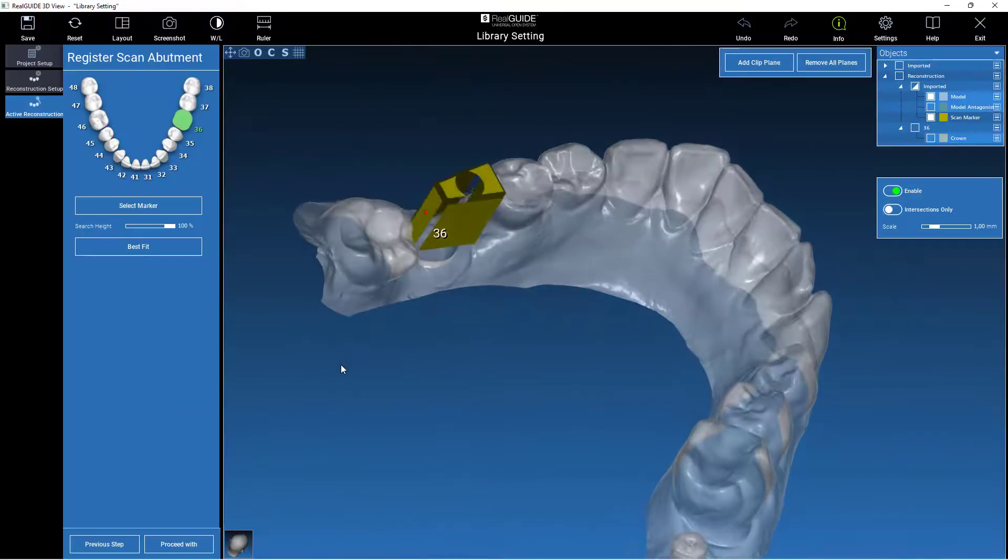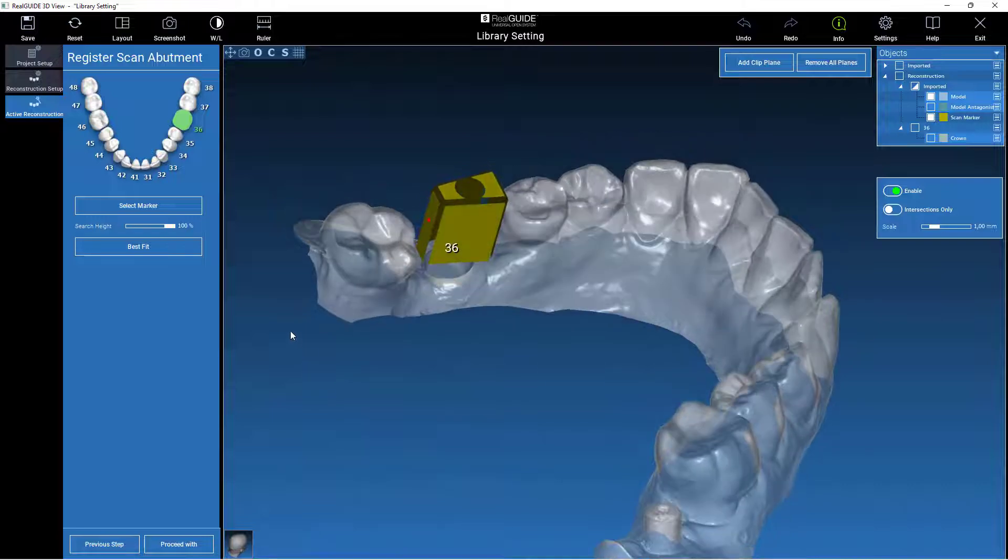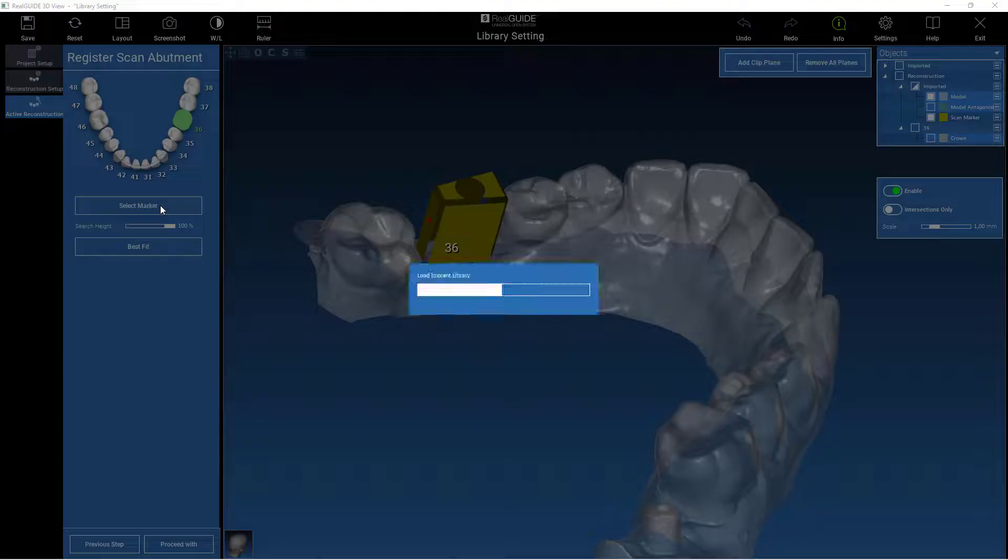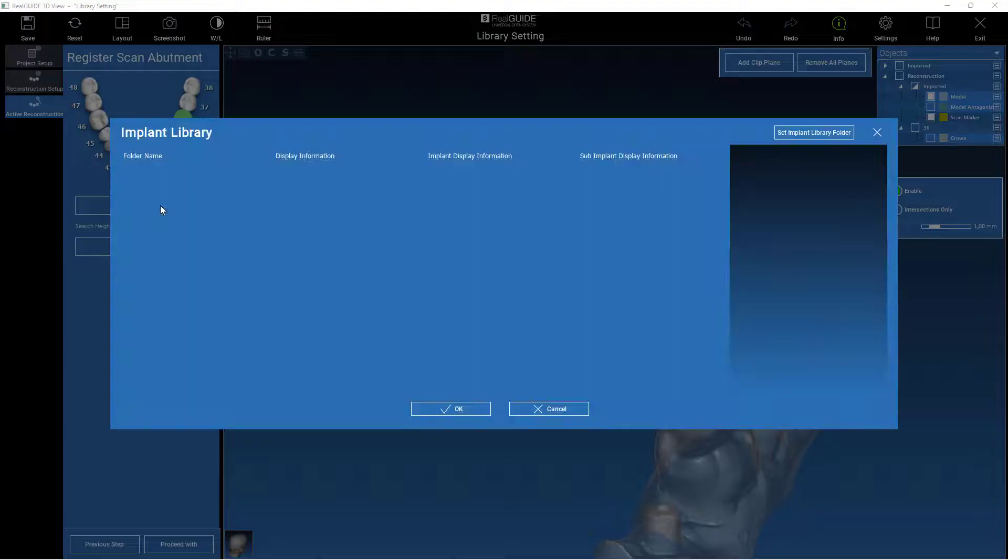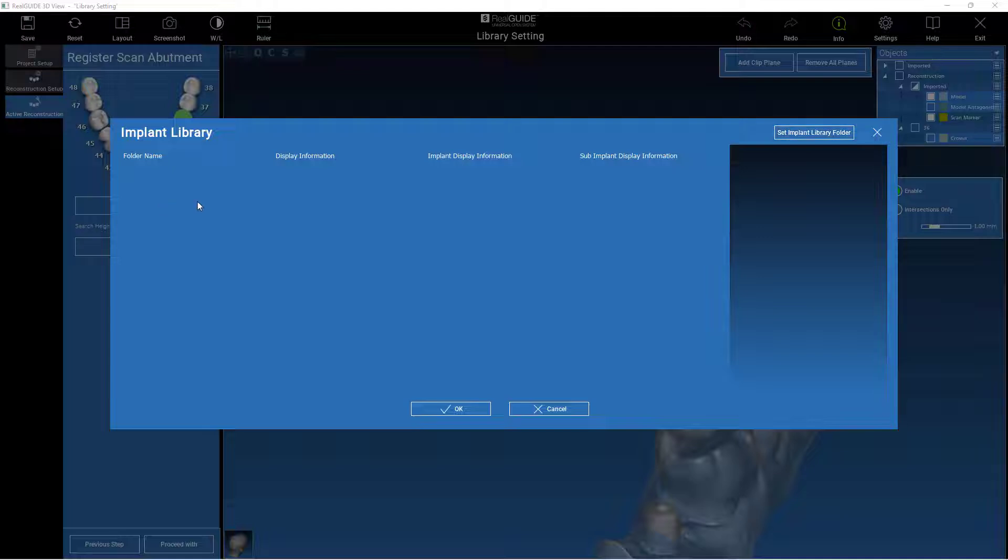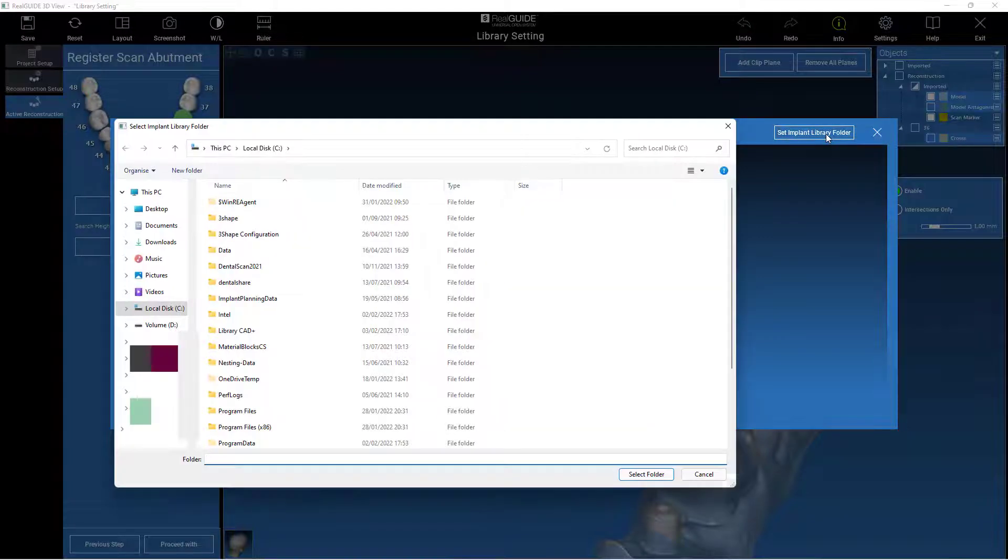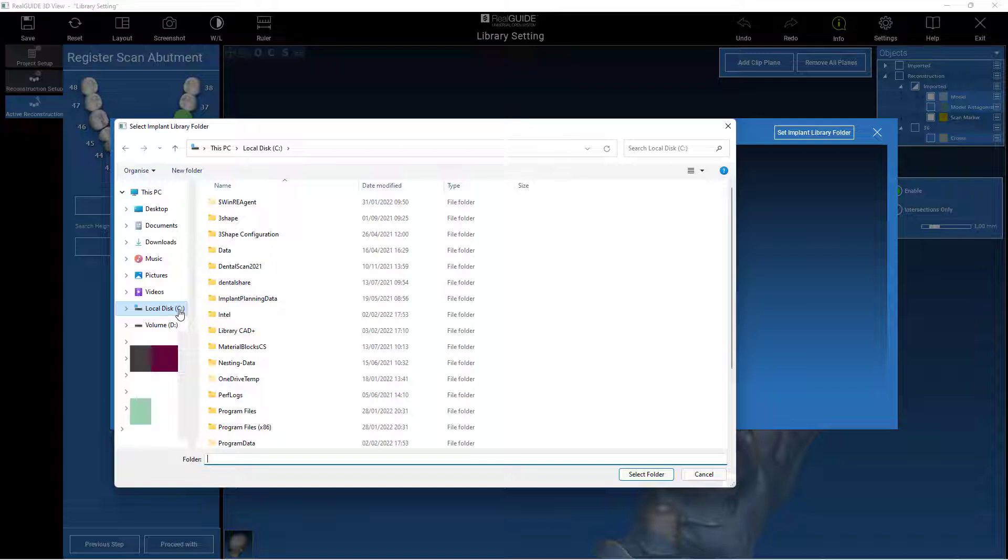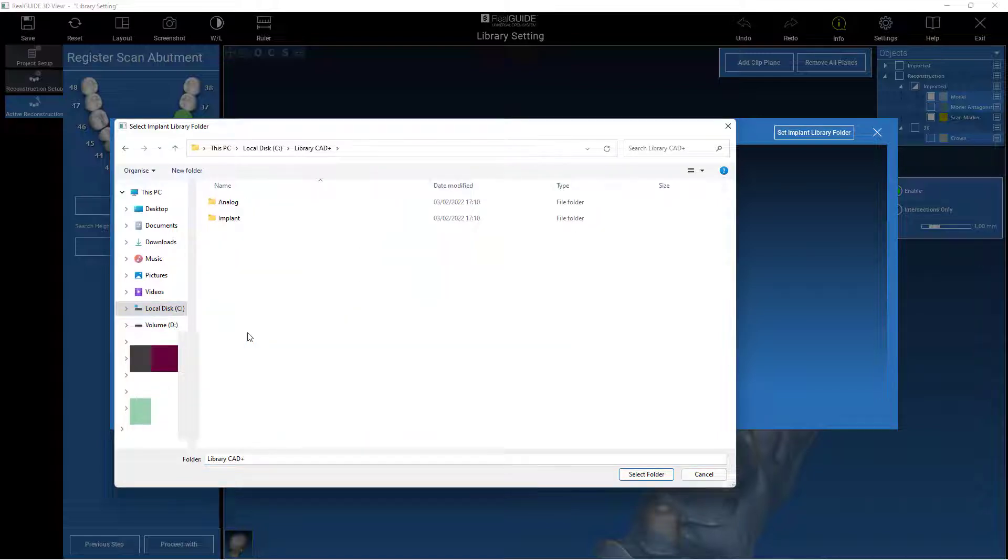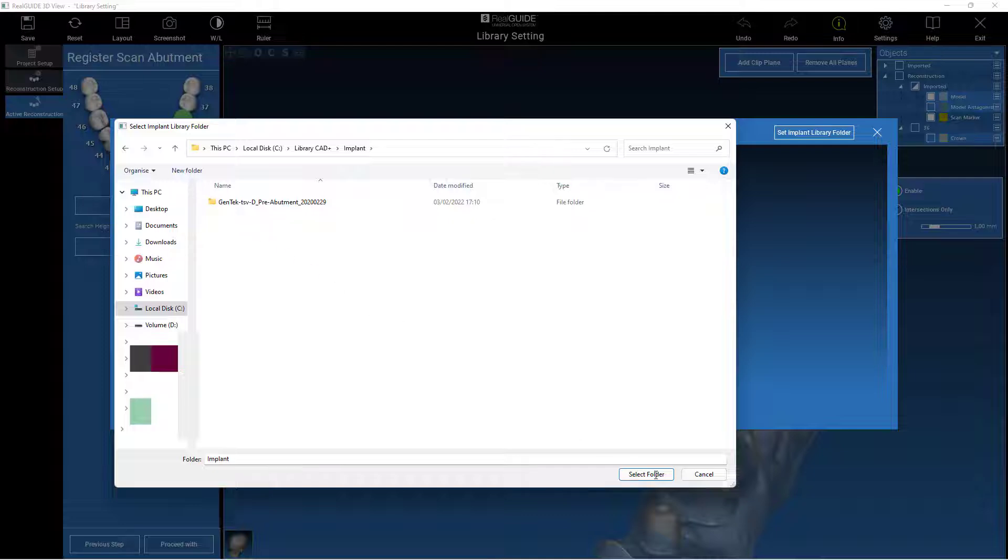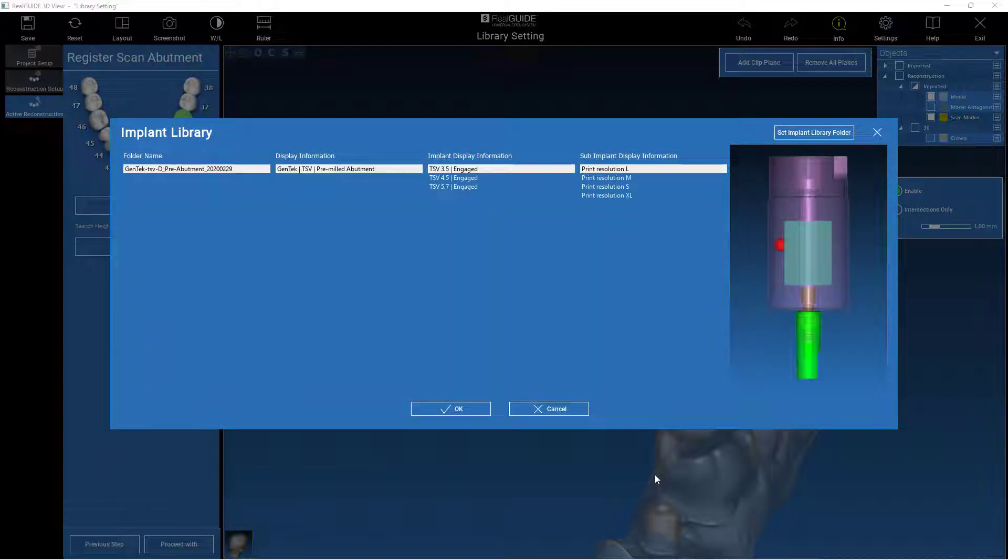In RealGuide CAD Plus, it is possible to select the folder where the libraries for the prosthetic part are located. During the alignment of the marker, we will then select the implant folder as the path inside the Library CAD Plus folder in the local disk C. And now it's possible to select the library needed for the work.